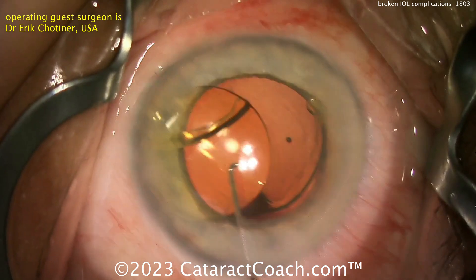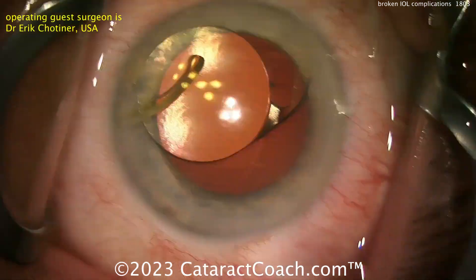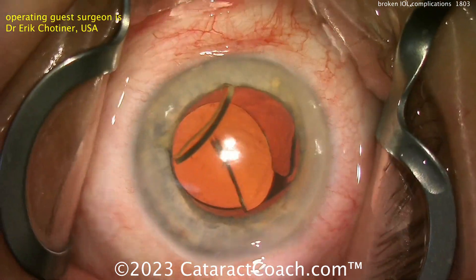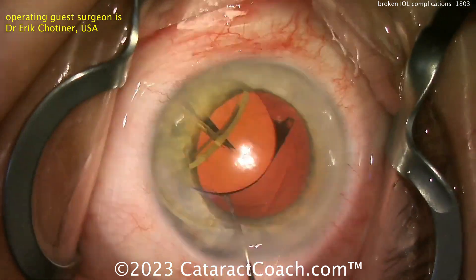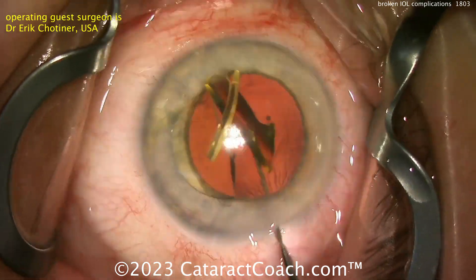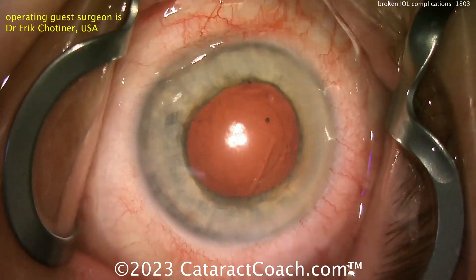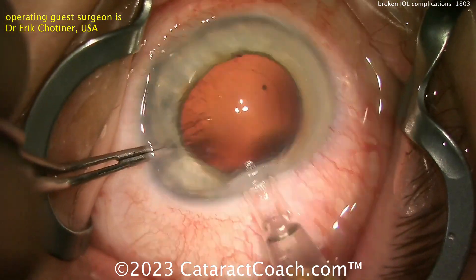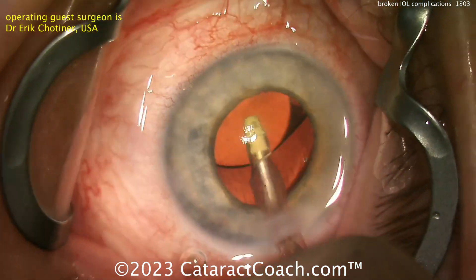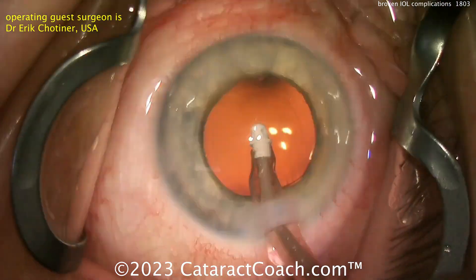There you can see that haptic is certainly broken — that just can't stay in the eye, it has to come out. These pieces can be cut, but be careful: you can damage the posterior capsule with those sharp scissors if you're not careful. I like that rotation 180, a little bit more cutting, and now these pieces can be taken out of the eye and a new lens implanted. Interesting case — I've not seen that complication before, but certainly anything can happen. Here's the new lens; it looks much better. The patient's going to have a beautiful outcome. All is well that ends well.